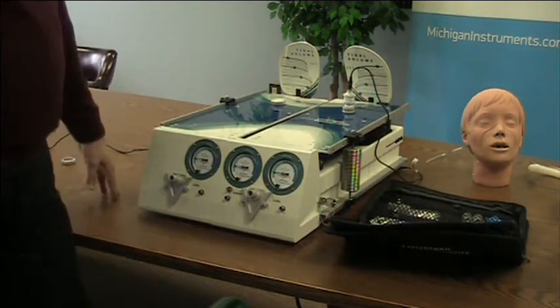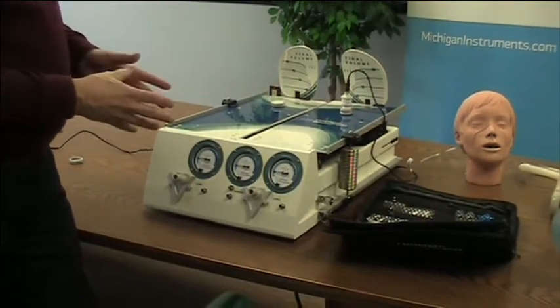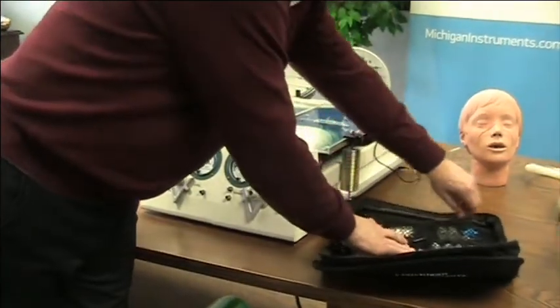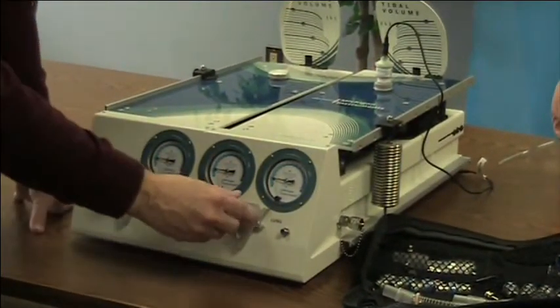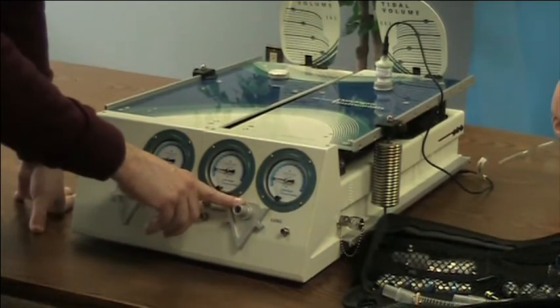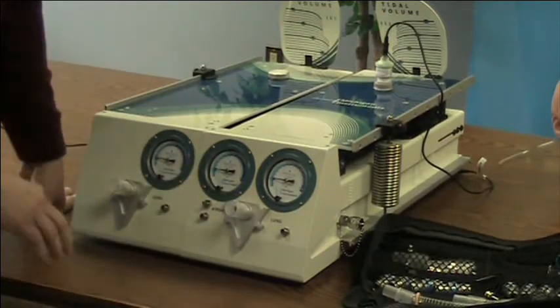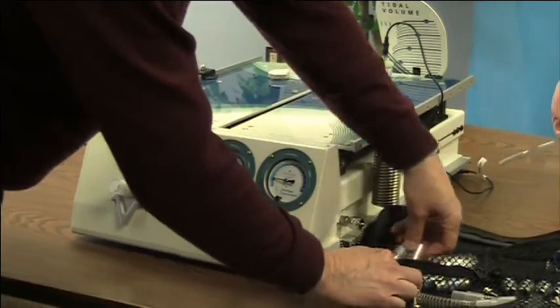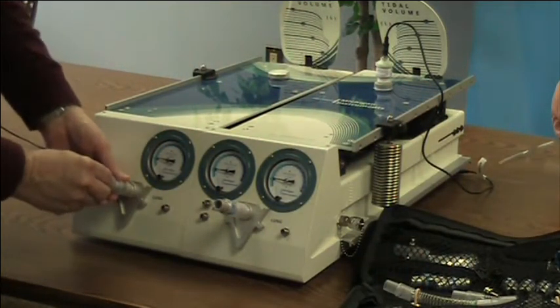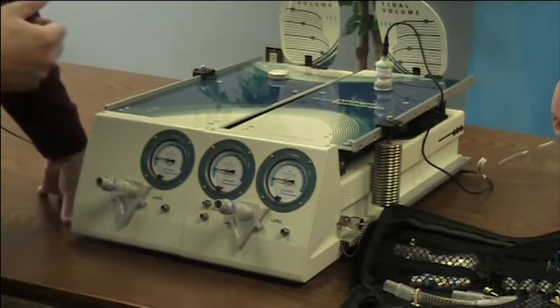I'm going to assemble an airway so that we're ventilating both sides of the dual adult TTL. To do that I take one of our straight barrel connectors. One thing you'll notice is that the connectors we use on the TTL are standard respiratory fittings — this connector has an outer diameter of 15 millimeters, this one has an outer diameter of 22 millimeters, so it'll fit your standard respiratory equipment. I'm putting an adapter in place and one of our resistors in place. We have five different resistor sizes: RP5, 20, 50, 200, and 500, so you select the resistance that you want to represent in this simulation.